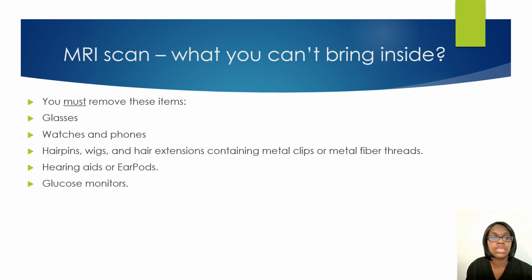Glucose monitors. You want to make sure that patients remove this. I've had patients tell me a lot, maybe all the time, that the last tech did not make me remove this. But sometimes patients get a CT scan and an MRI scan confused. So maybe the last tech didn't tell them because maybe they had a CT scan, or maybe they had another scan where it was okay for them to keep the monitor on. But just make sure you're removing the glucose monitor or telling the patient to remove it.